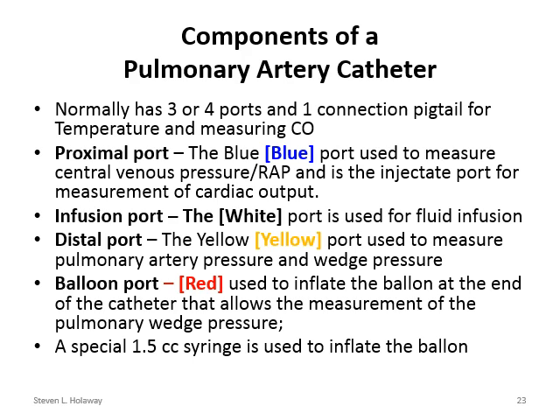When we measure cardiac output, we inject 10 milliliters of solution through there into the right atrium, and basically it calculates the change in temperature of the blood from the solution to the temperature measuring port, and then calculates the output on that.